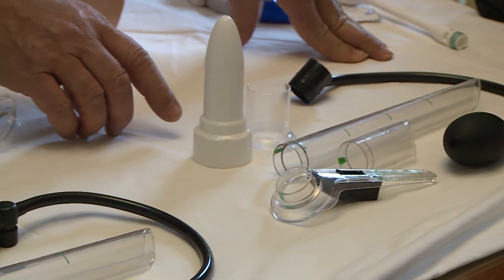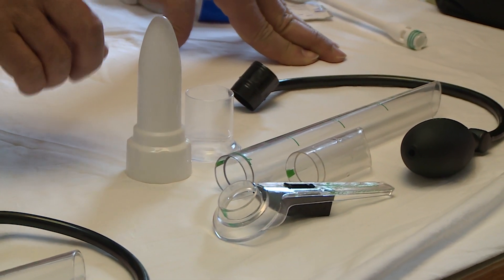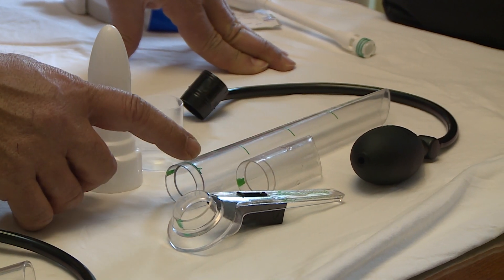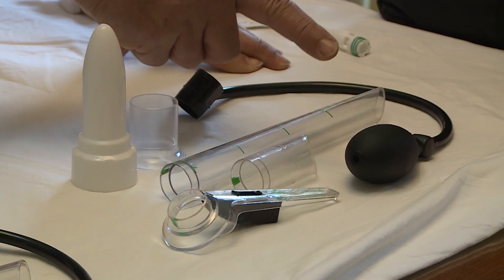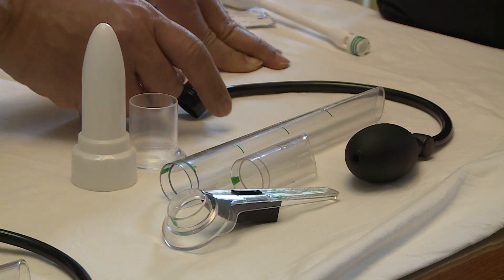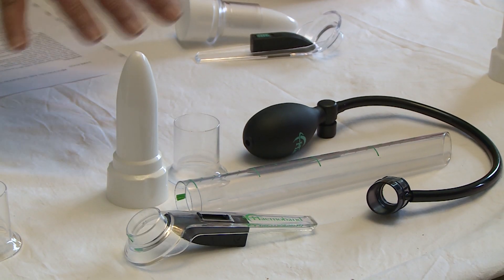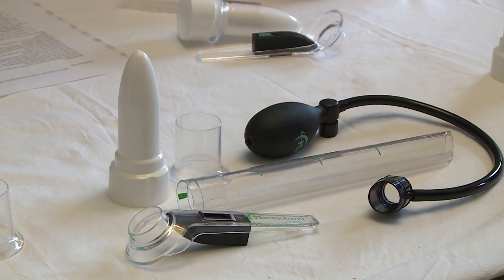The combo set contains the sleeve and trocar, the handle with the light module, the main body of the proctoscope, the main body of the sigmoidoscope, and the lens and air pump module together. All parts are single-use disposables only.